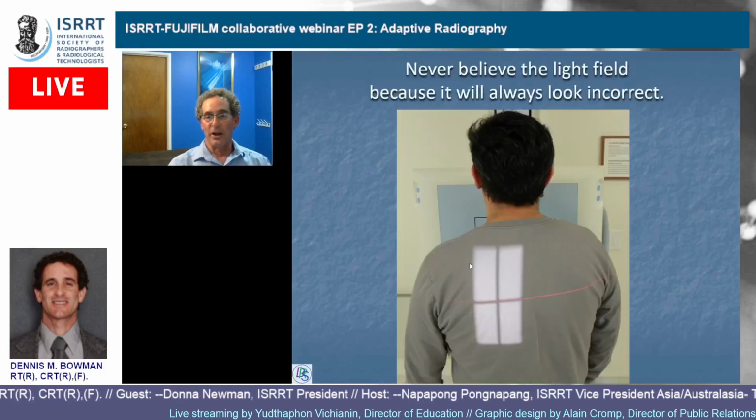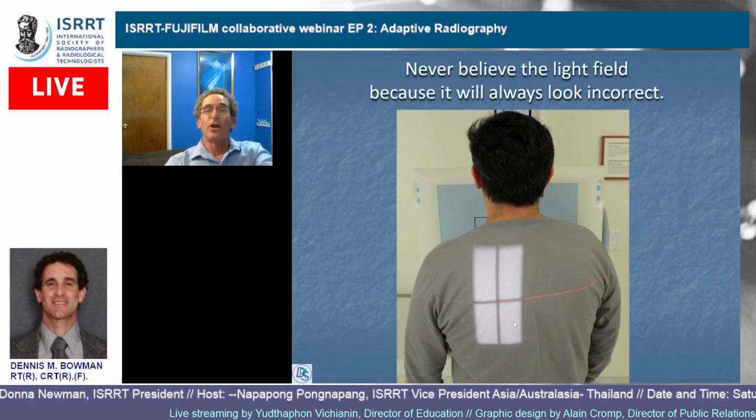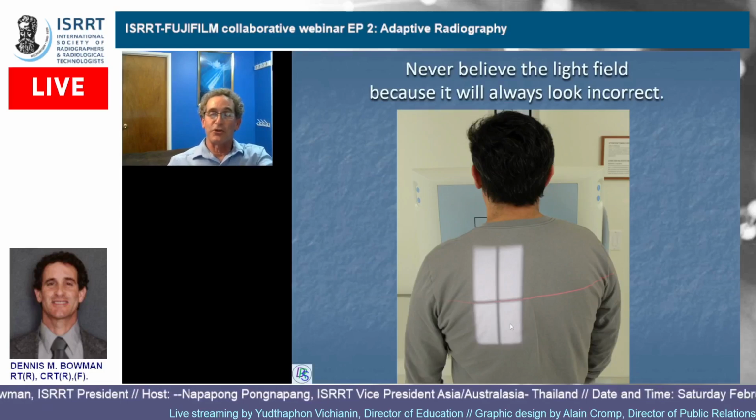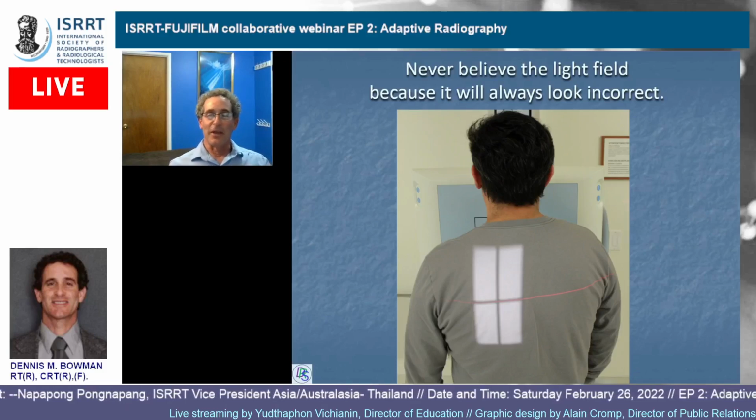Don't turn your light on, because if you turn your light on, it's going to look like a light somewhere in their back. Which is why if you look at the textbooks of how you're supposed to do a sternum, all they say is exit mid-sternum, which is not really that helpful. So this way is just awesome. It's going to work every time.